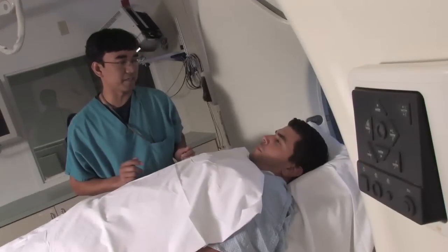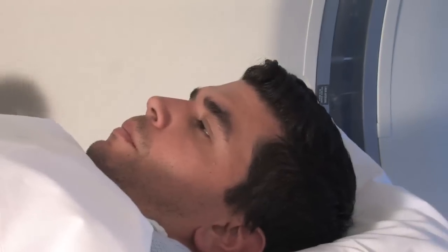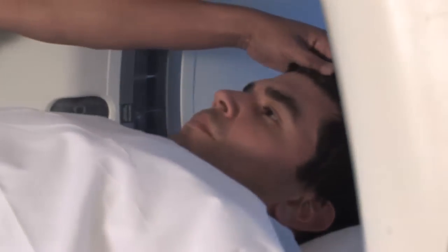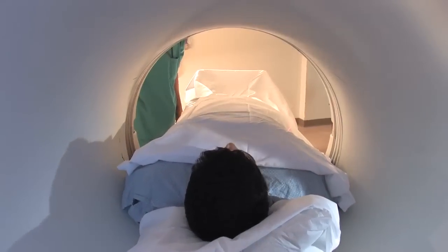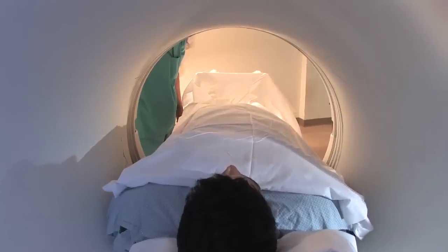PET scan, CAT scan — they're both non-invasive diagnostic tools a doctor will use to look inside the body. They're both used to pinpoint cancer, but have very different objectives and methods. A PET scan measures activity within a cell.